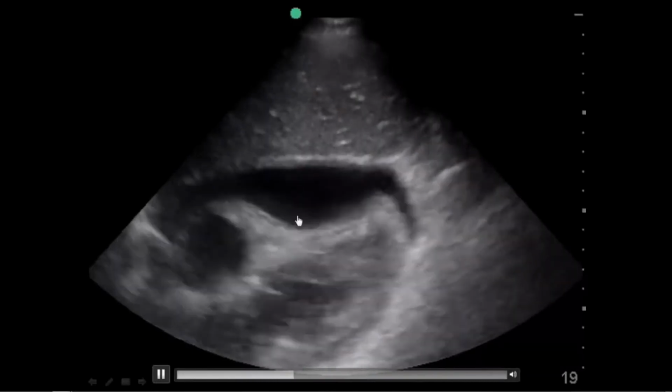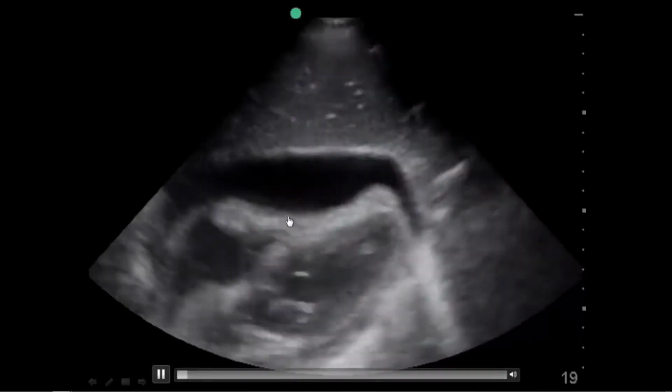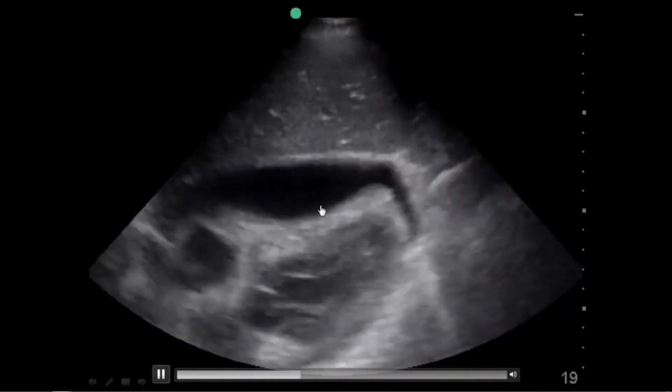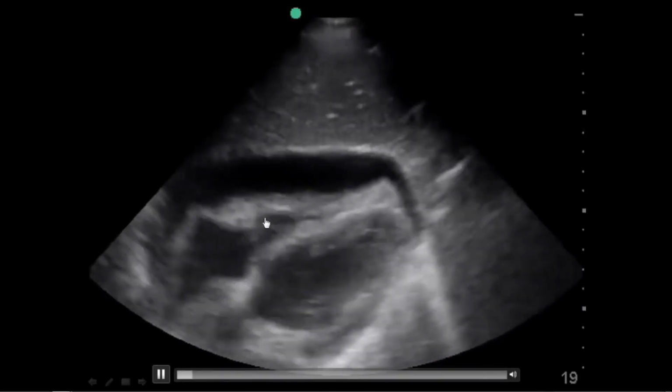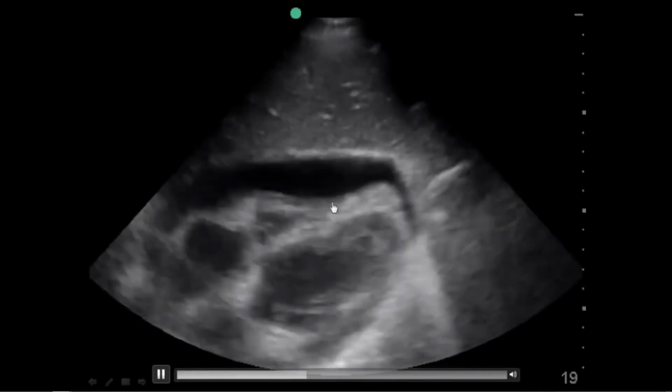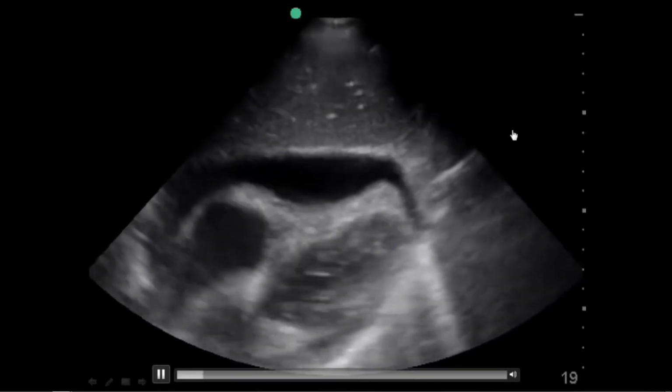It's been described by some people as a heavy kid on a trampoline. And here, in this case, it looks like the trampoline is not rising up at all. So we see this large effusion, which should mean tamponade, and also the fact that the right ventricle is almost entirely obliterated by the pressure.